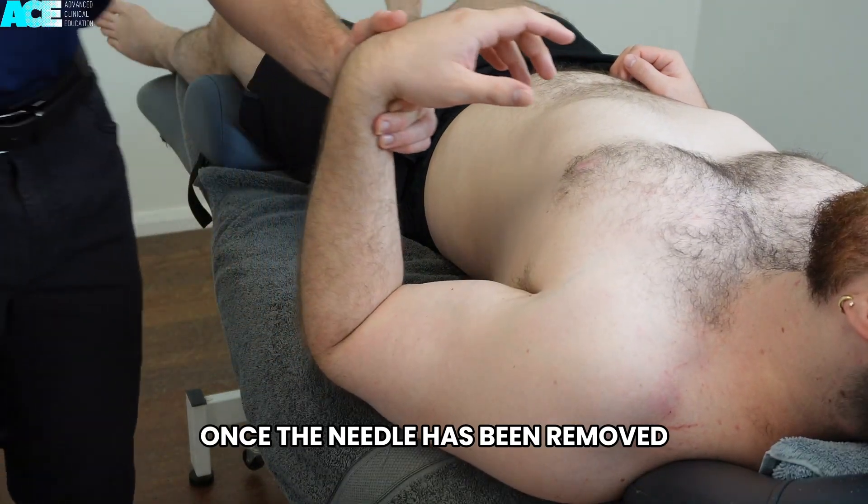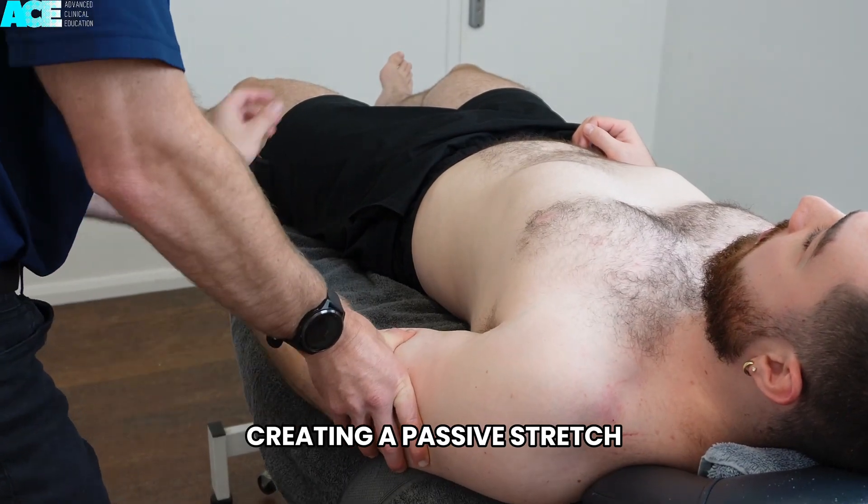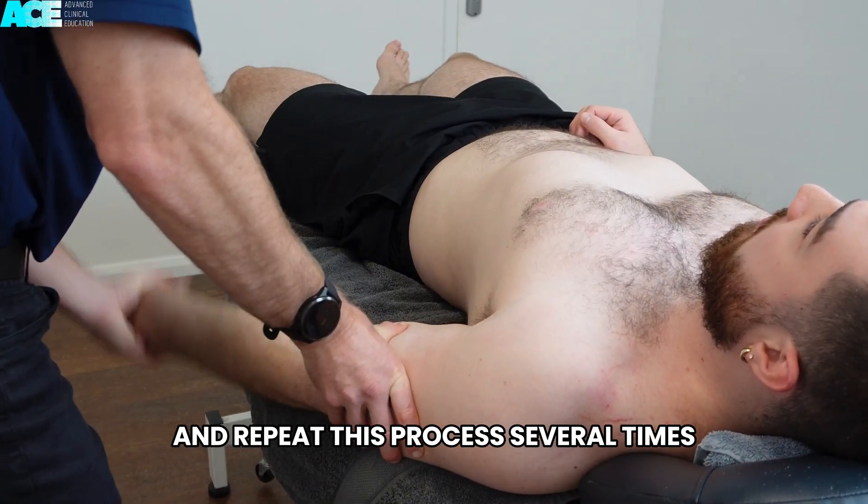Once the needle has been removed, move the patient's elbow into extension, creating a passive stretch, and repeat this process several times.